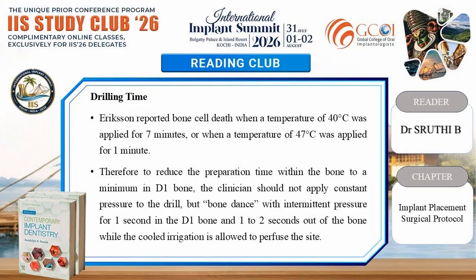Drilling time. Erickson reported bone cell death when a temperature of 40 degrees Celsius was applied for 7 minutes or when a temperature of 47 degrees Celsius was applied for 1 minute. Therefore, to reduce the preparation time within the bone to a minimum in D1 bone, the clinician should not apply constant pressure to the drill but bone dance with intermittent pressure for 1 second in the D1 bone and 1 to 2 seconds out of the bone while the cooled irrigation is allowed to perfuse the site.